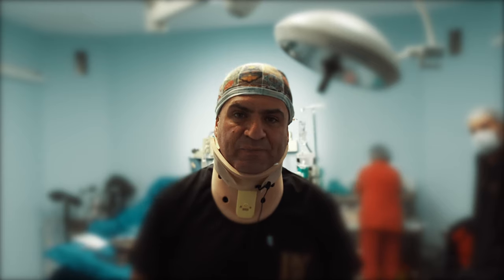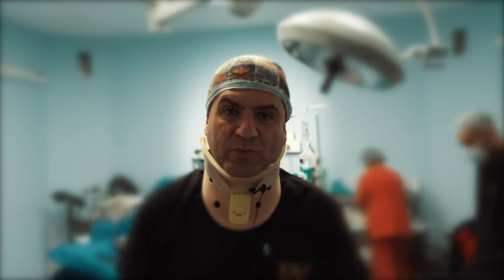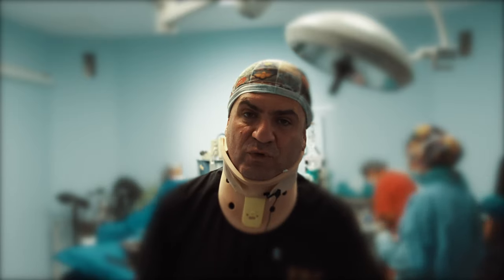Anyway, it took around 1 hour and 10 minutes. It's such an easy operation, and I placed the implants over the muscle, so she's not going to have too much pain, and that would be really good for her comfort.